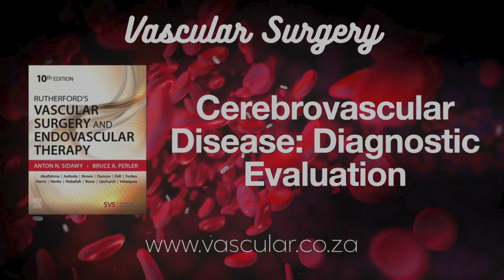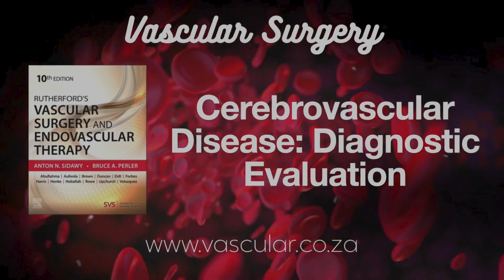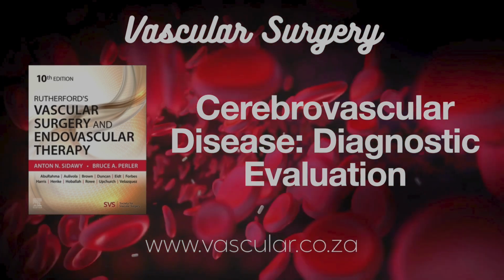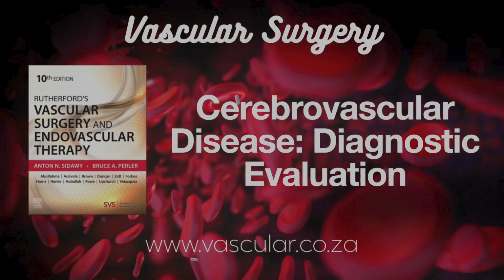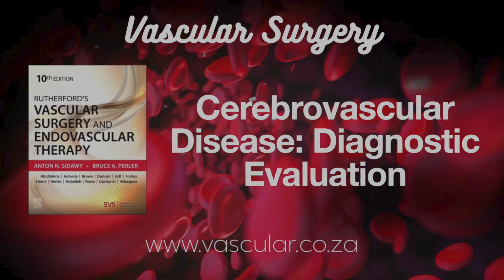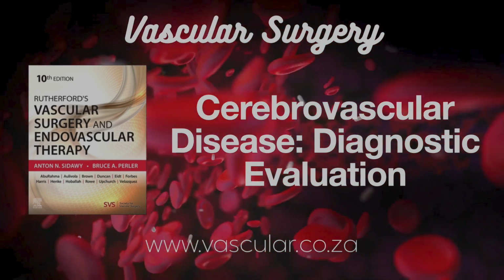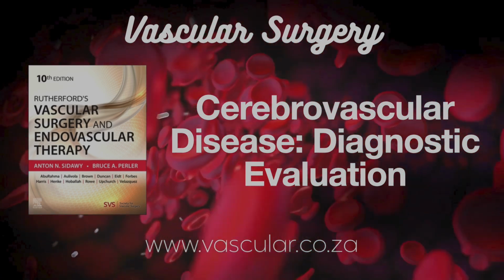What else makes it tricky? Calcium. Lots of calcium in the plaque. It's hard, dense, and ultrasound waves don't penetrate it well. It casts a shadow, an acoustic shadow, blocking our view behind it. Like trying to see through stone. Exactly. Makes getting accurate velocity measurements difficult sometimes. Also, telling the difference between a super tight stenosis, almost closed off, versus what's called a string sign, just a tiny trickle getting through, that can be hard with DU alone.